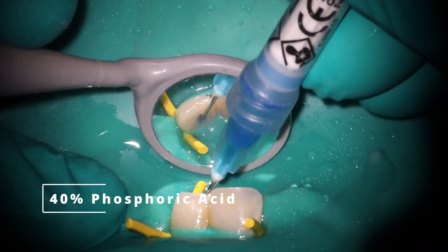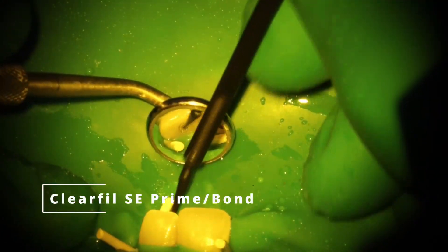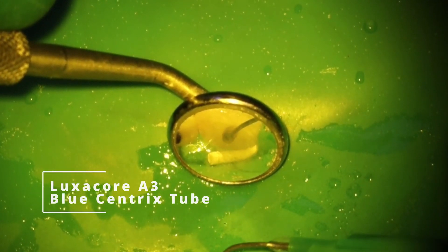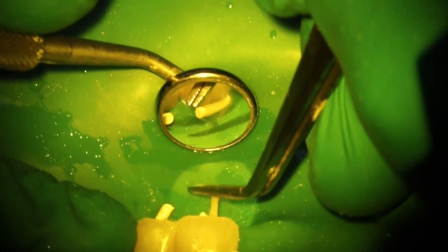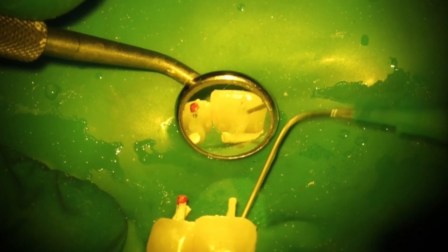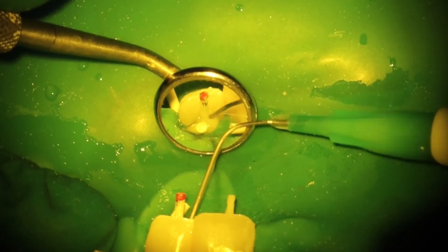Using the same process: Disclose, blast it away, Total Etch Technique with 40% phosphoric acid, come in with ClearFil Prime and Bond, and then fill it up. I'm still going to use a blue Centrix tube here — you can sometimes with larger cases get away with the brown. I did extend this part out where I'm doing the post. About doing the post: I actually removed the red stripe on number 9 because you don't really want to have a red spot when you're sealing this up — just take a burr and quick buzz that off. Also, you need to go back in with the Centrix tubes after you place it, and then also go back in with the Glick. If you don't do this, there's a really high chance you're going to get a void at the occlusal or lingual aspect. You can just take the barrel bur, smooth that all off, get a nice shape, and check the bite.